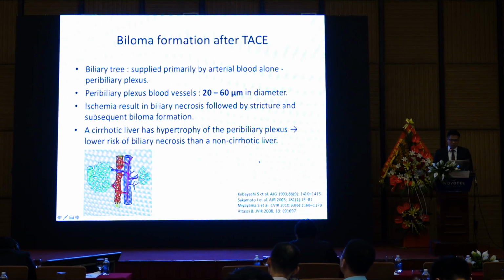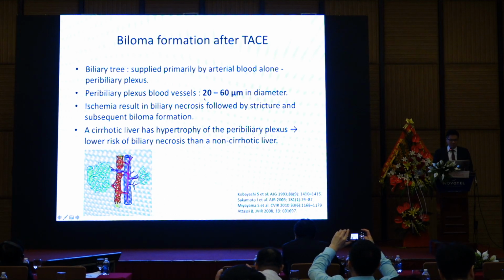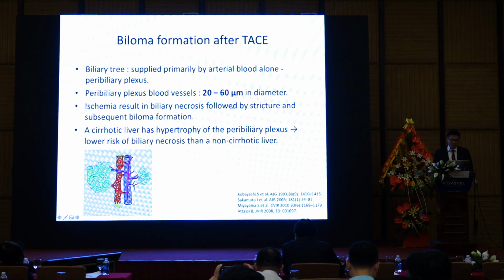As Dr. Chong has mentioned, there is the complication of DEB-TACE such as biloma formation. This is what we need to take care of when we do DEB-TACE, because the peribiliary plexus blood vessel is near 20 to 60 micrometers. So if you use a bead size close to 60, that may cause embolization of the peribiliary plexus blood vessel, which may cause biliary stricture and the subsequent biloma formation.